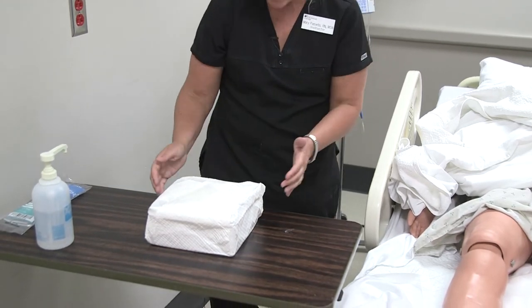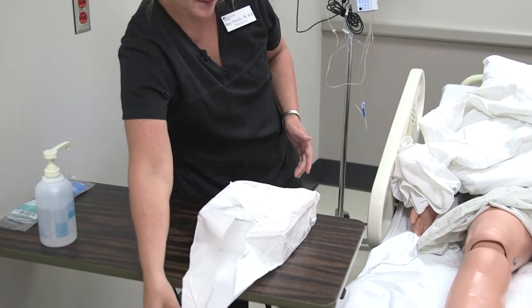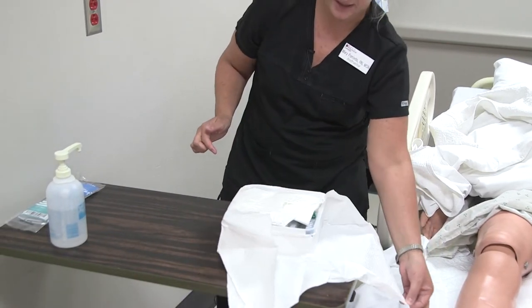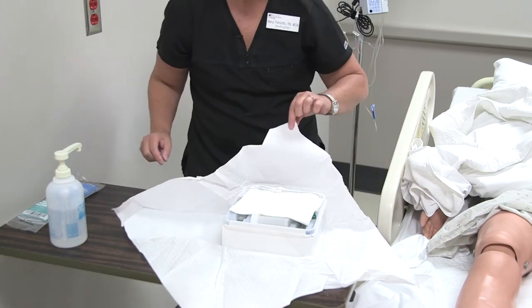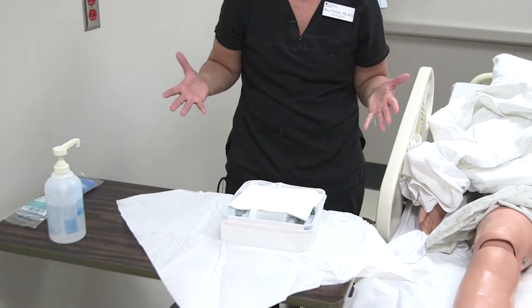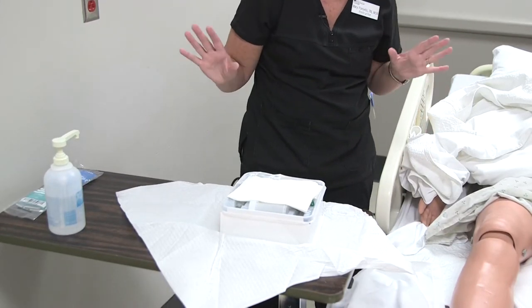All right, so when you are opening a sterile field, you want to make sure that you always open the outer flap away from you first. And then you want to just touch the very outside, because you don't want to touch the inside, because then it'll become contaminated. So now this is your sterile field, so you don't want anything to touch the inside of that. You've got the 1-inch boundary that can be contaminated, but that's it.